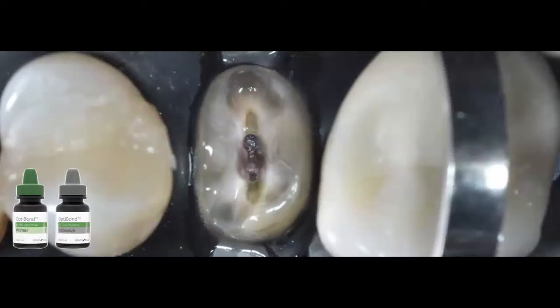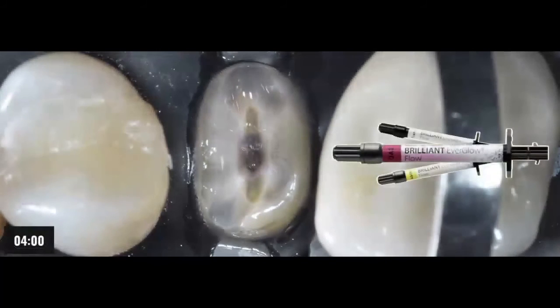So that's the area where I want to, in one way, shape, or form, increase my bond strength. So what I'm going to do now, again, same steps. I didn't etch the dentin. I used Aquacare to clean the smear layer. I'm going to apply my 2-step bonding system, and the one that I use is OptiBond eXTRa Universal. Step 1 and step 2, the primer and the adhesive. Once I have both, I light cure, and then my next step is going to be my resin coating layer.